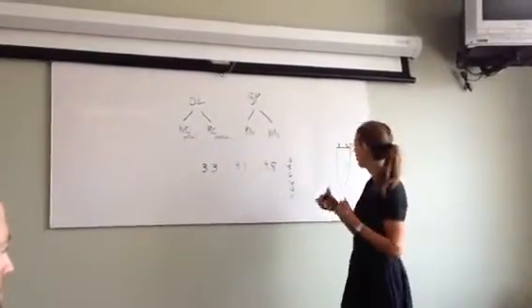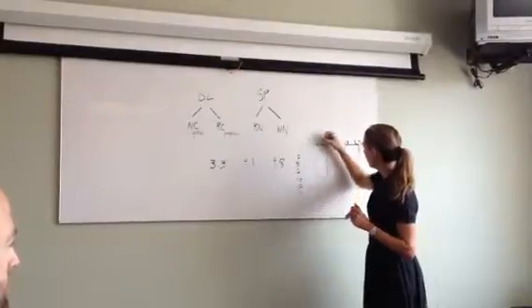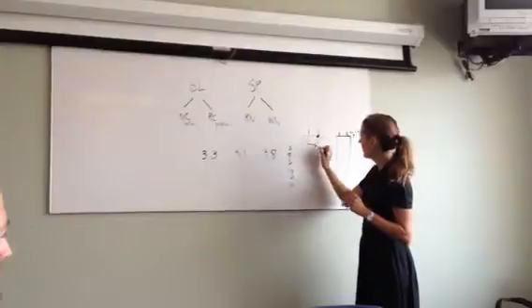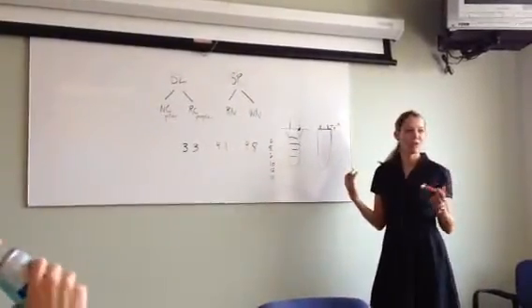Bone loss. Right, so in the old days, if you had bone and you had your implant and your abutment connected, right here was your microgap, you lose bone down to about the first thread, right? That's the urban myth with implants, right?